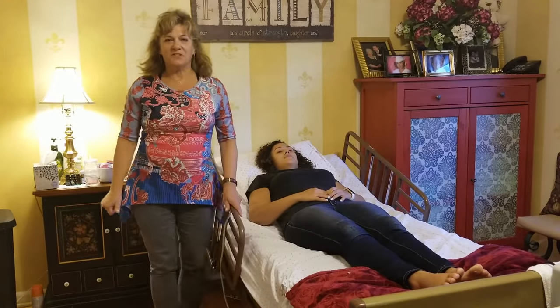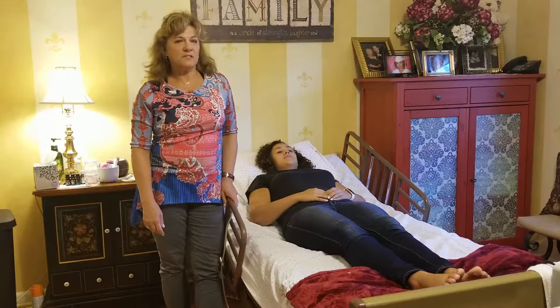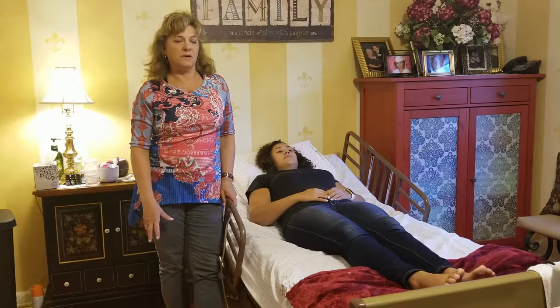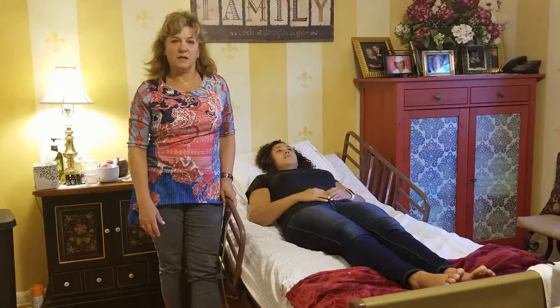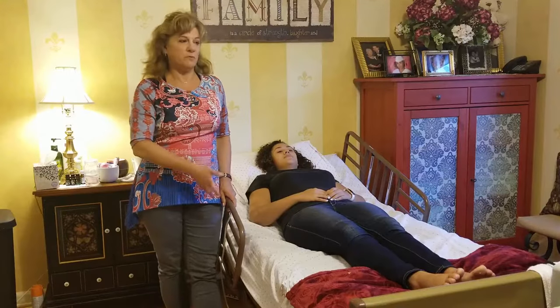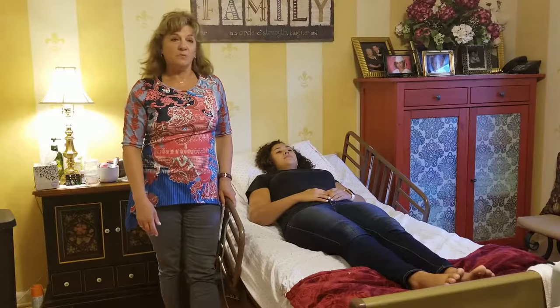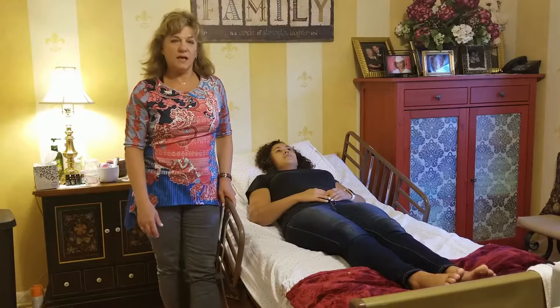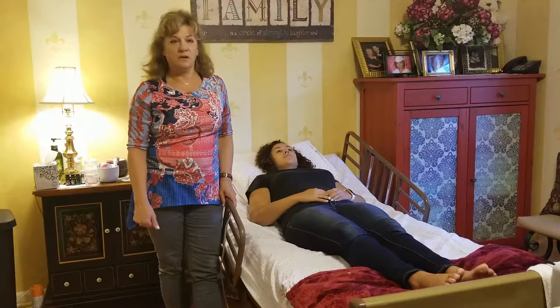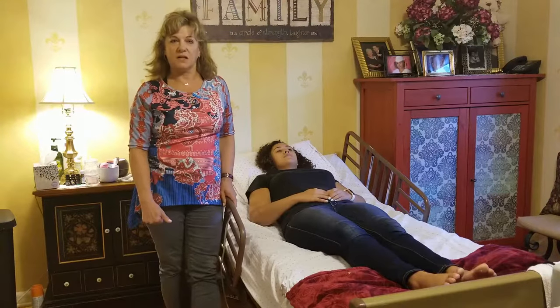Hello everyone, I'm Nancy Rhodes, the nurse practitioner, and I'm here to show you how to use a Hoyer lift. A Hoyer lift is a large device that works for people who cannot stand or transfer without more assistance than one person can provide. It makes you very independent as a caregiver — you can move people from 100 up to 400 pounds from a bed to a chair or wheelchair, and vice versa.